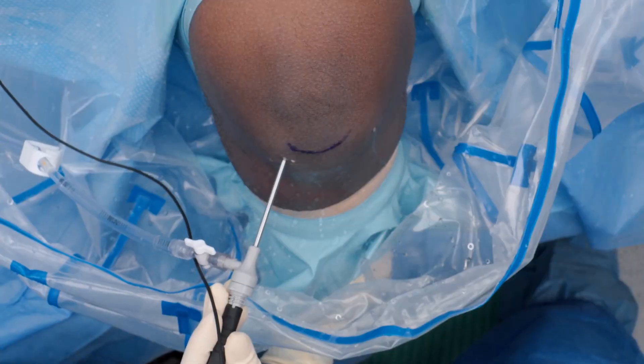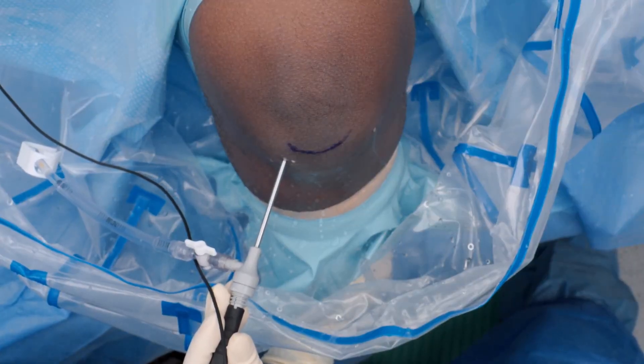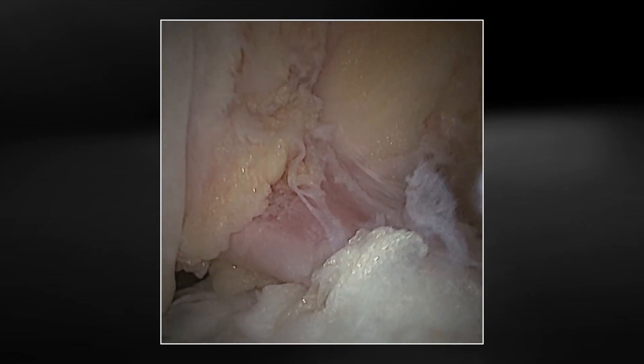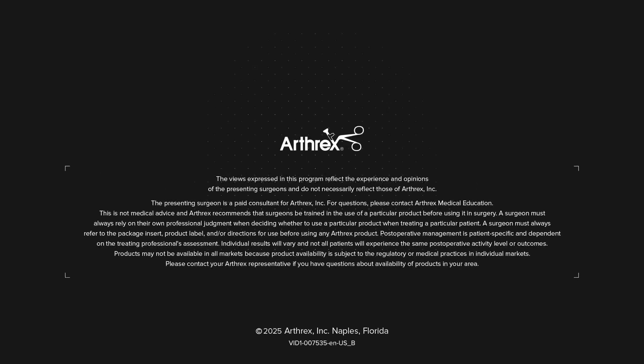As you can see from our diagnostic arthroscopy with the Nano Needle 2.0, this new system gives us much higher definition compared to the 1.0. You can see the resolution difference, the coloration, the saturation difference, as well as the illumination in those dark corners. This is a huge game changer in my practice. I hope that all of you get to use it and consider it for your standard knee arthroscopy.